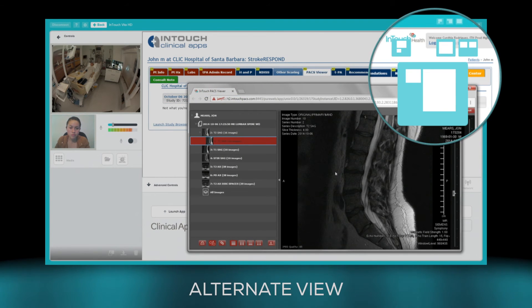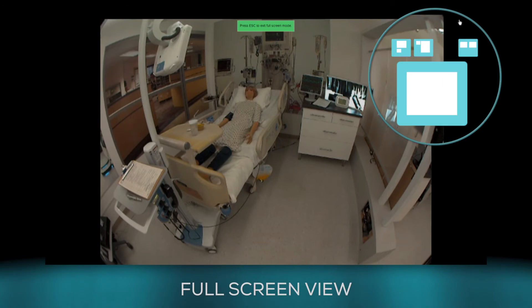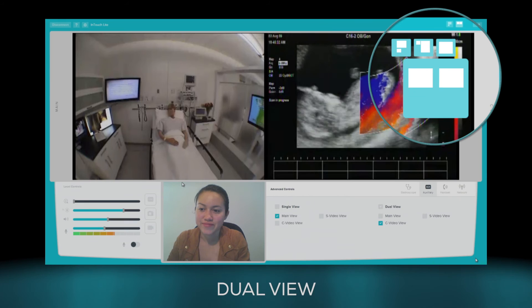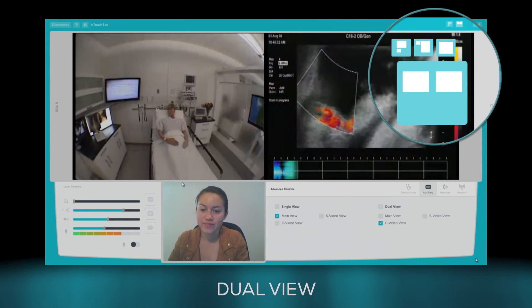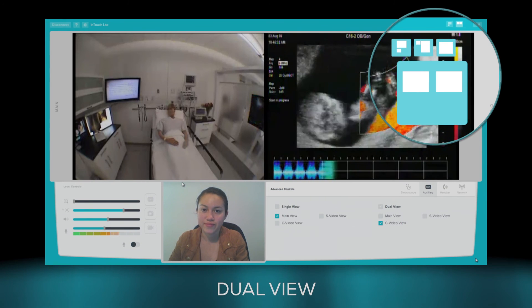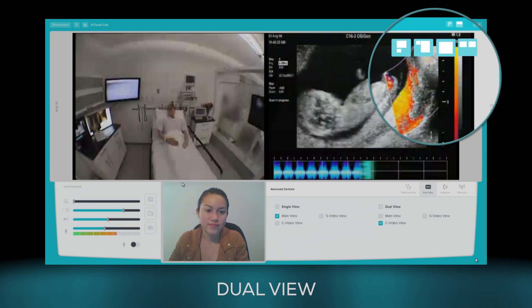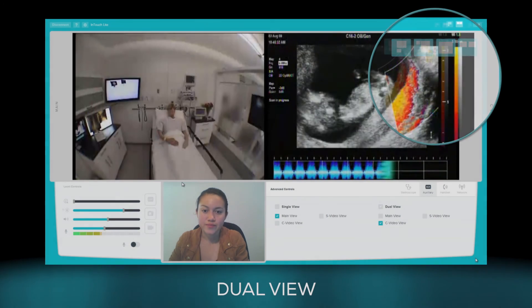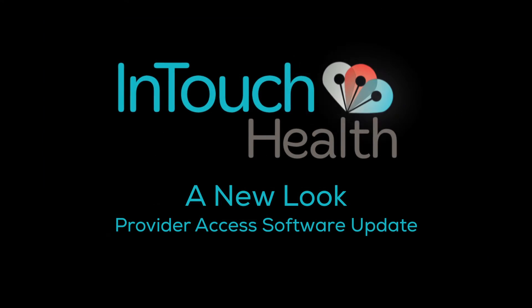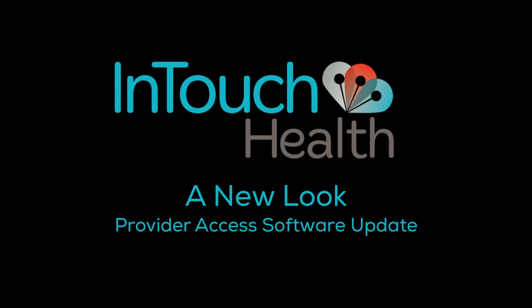The full screen view lets you view patients in full screen mode. The dual view allows you to receive diagnostic data from peripheral medical devices while you examine your patient. The new Provider Access software — the same great user experience you trust today.